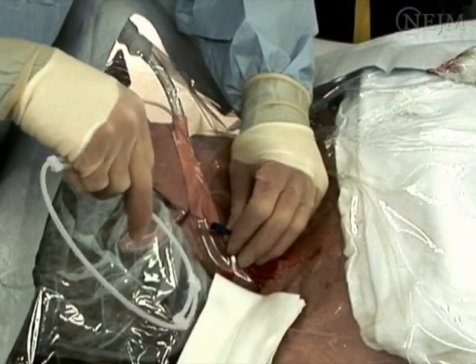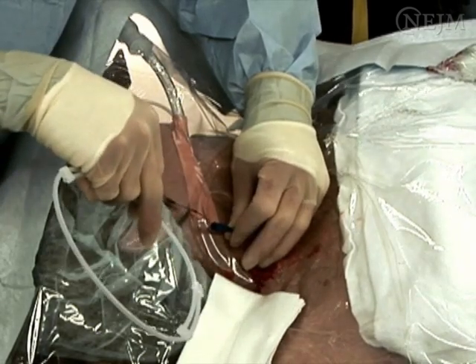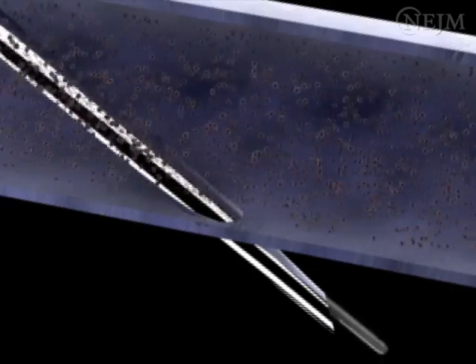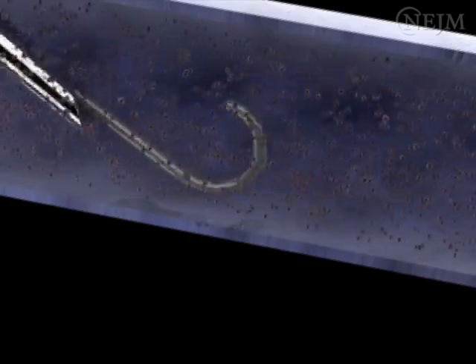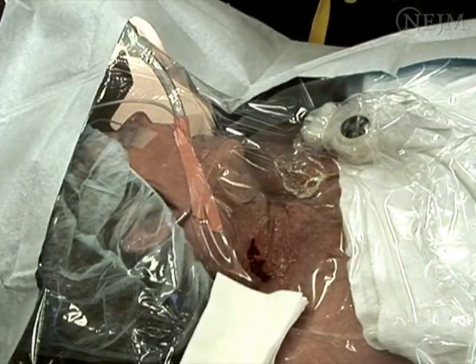If the wire will not thread through the needle, you may need to adjust the placement of the needle, since it may have inadvertently been advanced during manipulation. If so, adjust the needle and re-aspirate to be sure that you are still within the vessel. If you are unable to re-establish blood flow, remove the needle and start over.